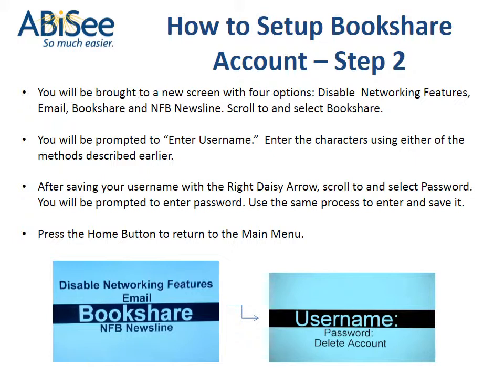After saving your username with the right daisy arrow, scroll to and select password. You will be prompted to enter password. Use the same process to enter and save it. Press the home button to return to the main menu.